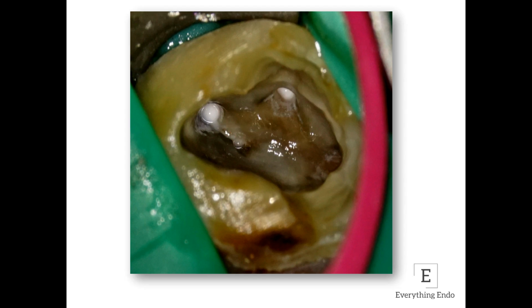Another way of going about it is by drawing again a line connecting the MB to the palatal, and then a line that connects the distal buccal to this line perpendicularly, and at the point where these two lines meet, I would draw a 1 or 2 mm arc. The chances of the MB2 being on this arc or on the perimeter of this arc are again extremely high. So these are two techniques where you can just imagine lines present on the floor of the pulp chamber in case you are unsure about where to find the MB2 canal.